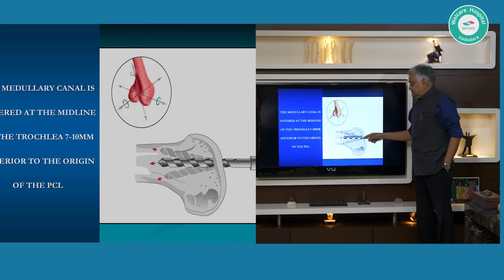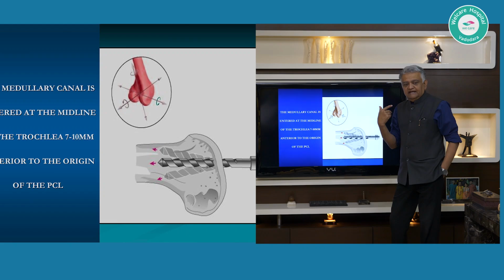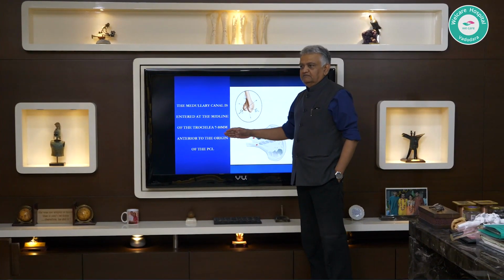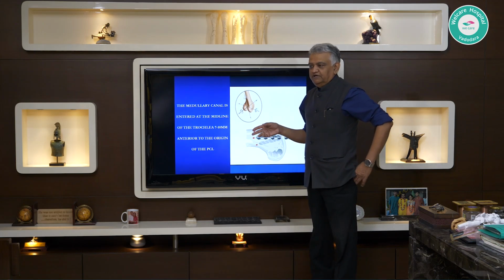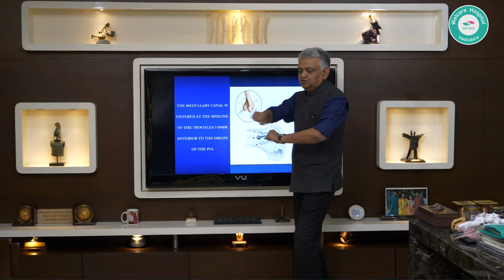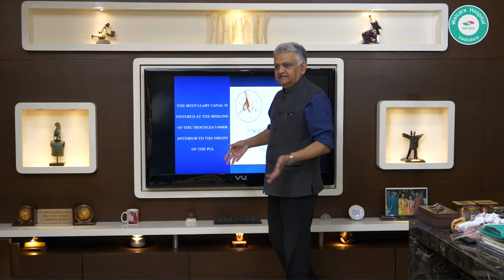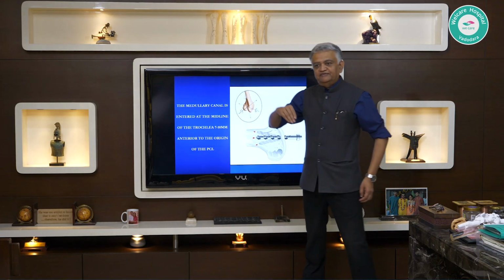which now has some space around your rod, allows the fat to migrate out, so that you do not create fat embolism by pushing a rod in a space where there is no further space. And now the only way the rod can make a way for itself is to push the material which is already in there aside, and that material is marrow fat, and that marrow fat, when you are pushing it aside, might go into the vasculature and cause fat embolism.